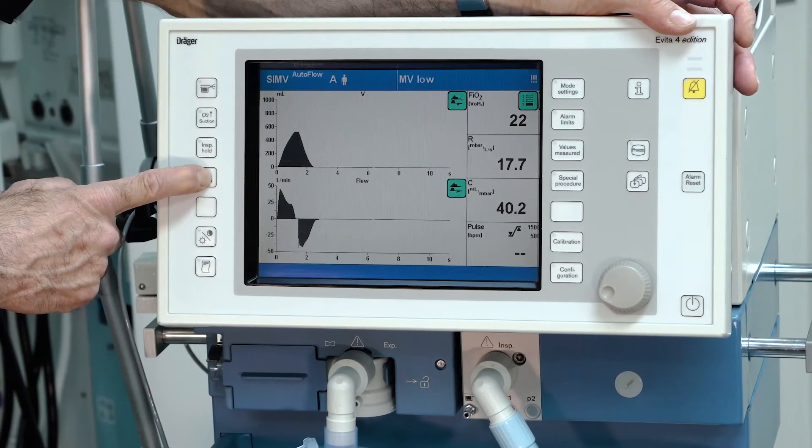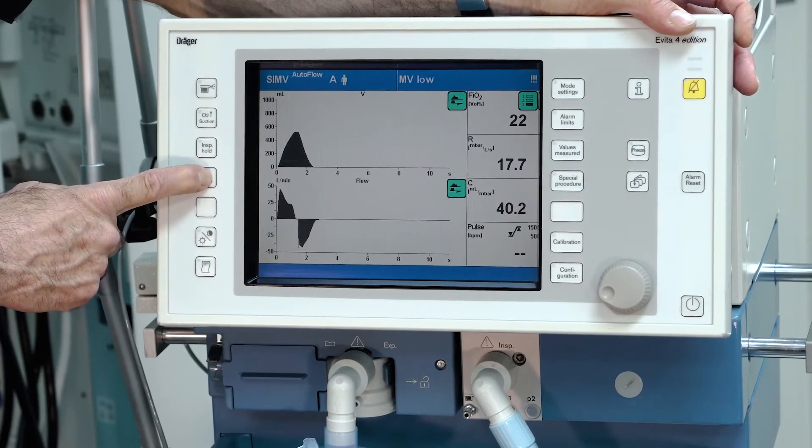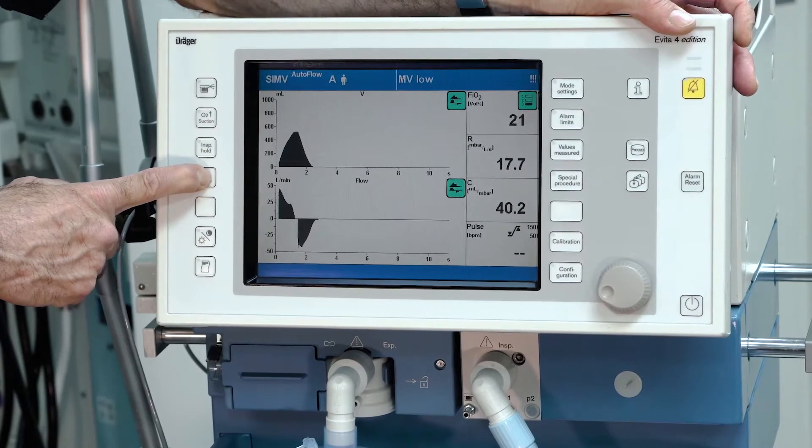Expiration hold is one button below. As long as you hold the button, the expiration is held.